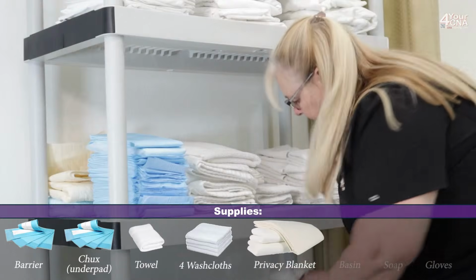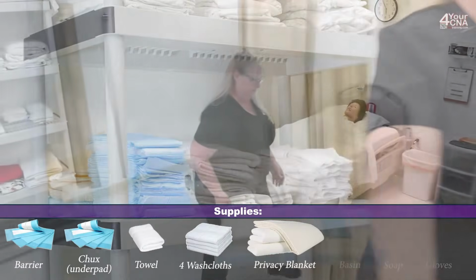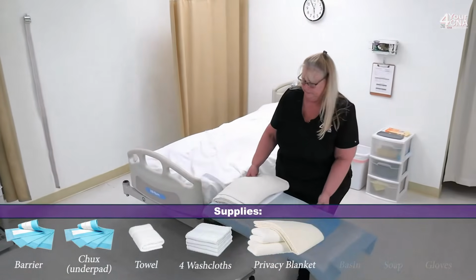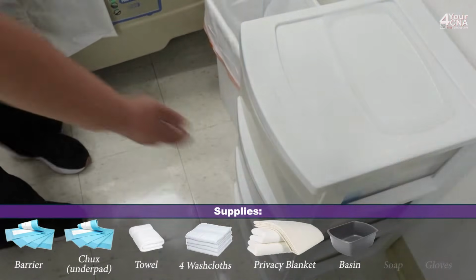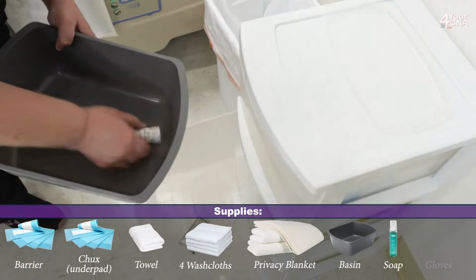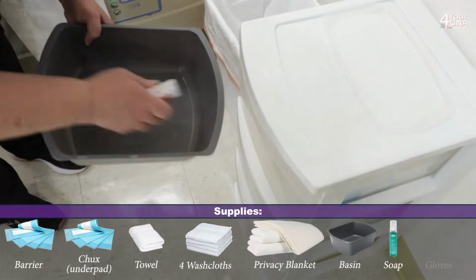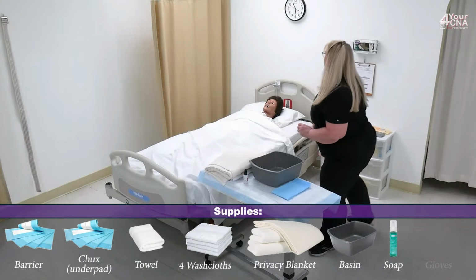We're going to need a privacy blanket. We'll bring this over to the patient area. And I'm going to need a basin and soap, and a set of gloves.